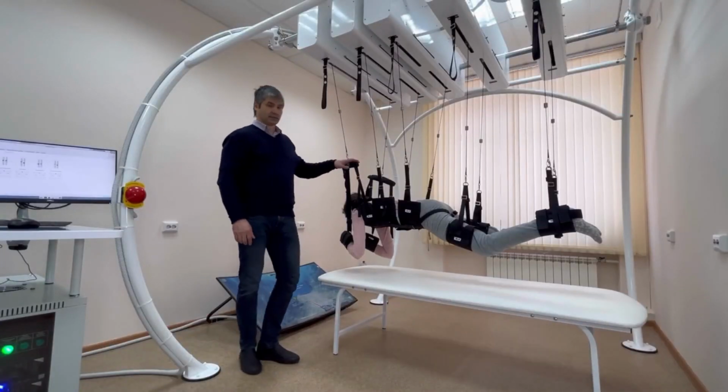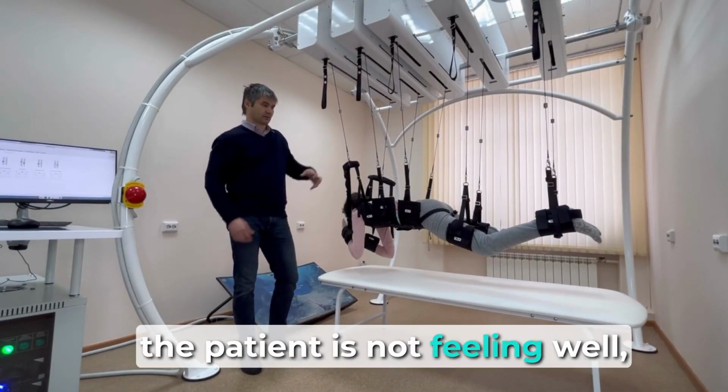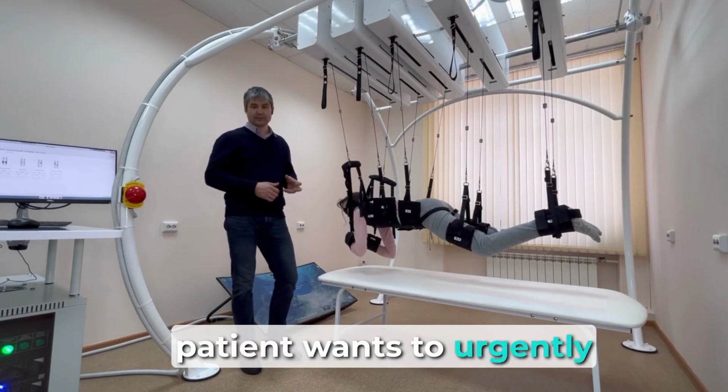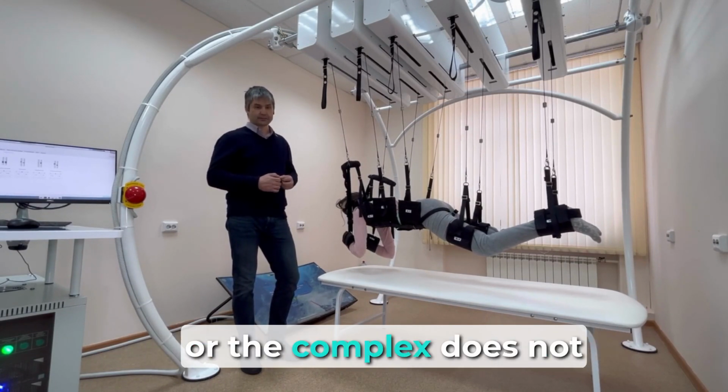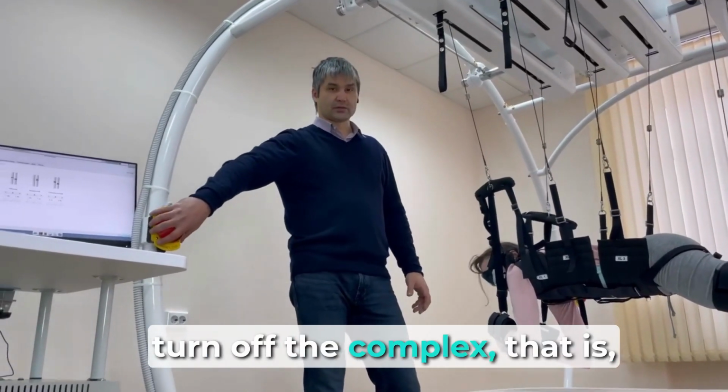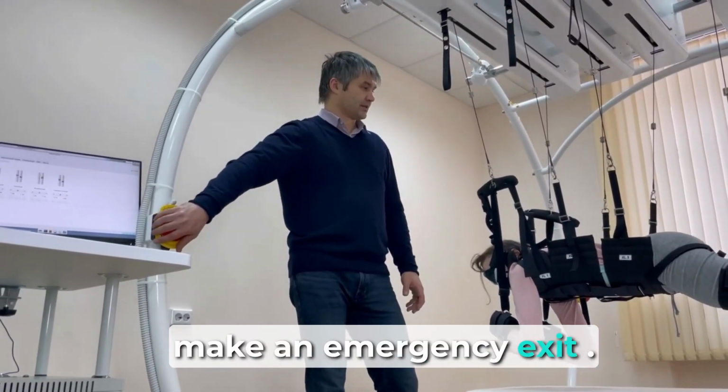Situation: if the operator does not see a solution, the patient is not feeling well, there is severe discomfort, or for some other reason the patient wants to urgently complete the procedure, or the complex does not respond to commands, you can press the red button, turn off the complex, that is, make an emergency exit.